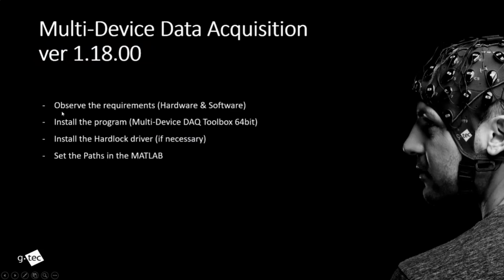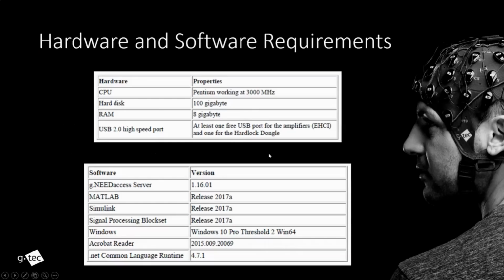So today I will go through some requirements for using this toolbox. For the installation part, I will partially go through it by the menu. Then we'll see some real examples of how we run it through MATLAB.